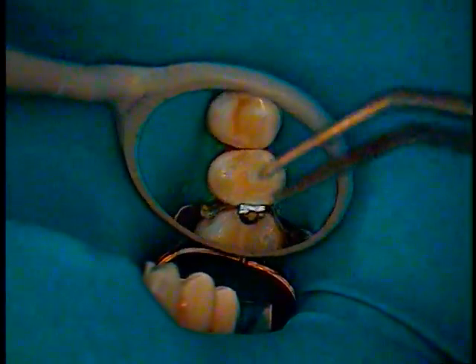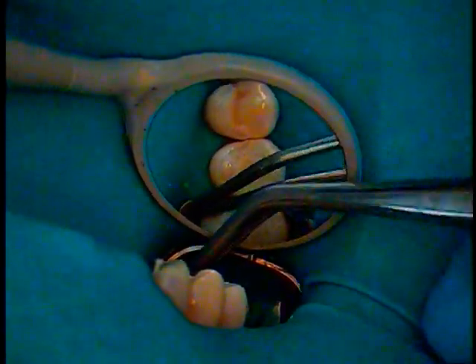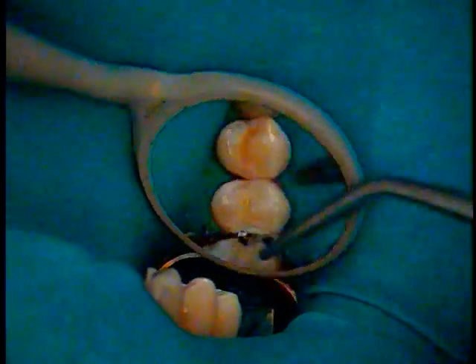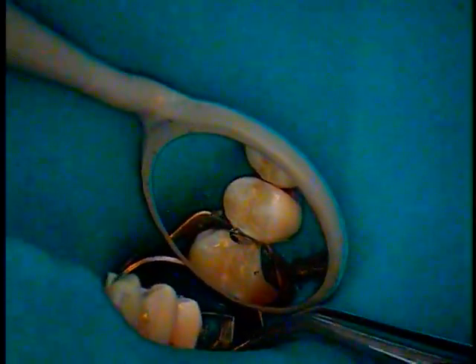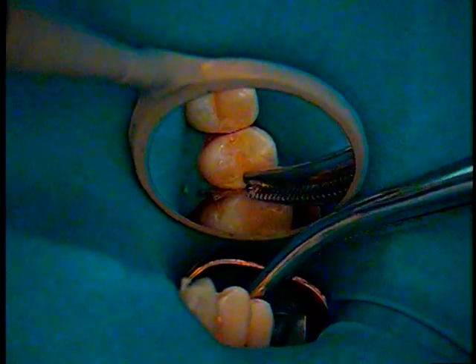Okay, so now I'm going to remove the band and the wedge. Sometimes I have to use something a little bit stronger. Here comes the wedge. I'll just sneak that one out first. And then a hemostat. Okay, hopefully this will do it. And you can see how that band came out nicely. Now I'll just go right ahead and start polishing.